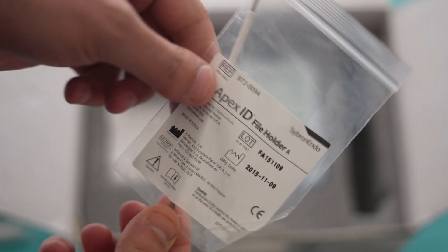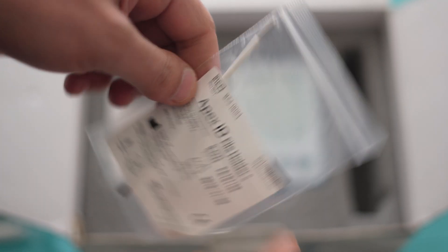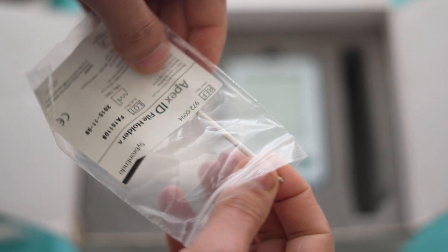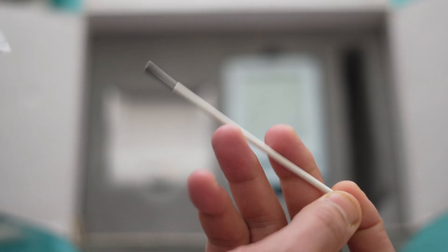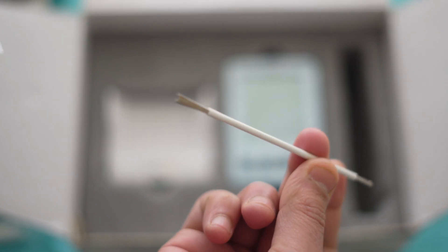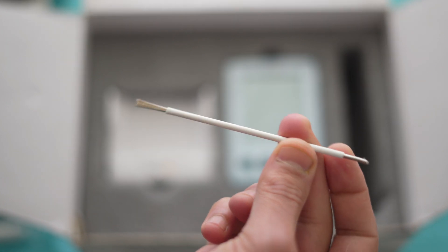The Apex locator also comes with another type of file holder — this is file holder A. I personally use this type of file holder because it's very easy to use during the procedure. For holding the file you just need to attach this file holder to the file.